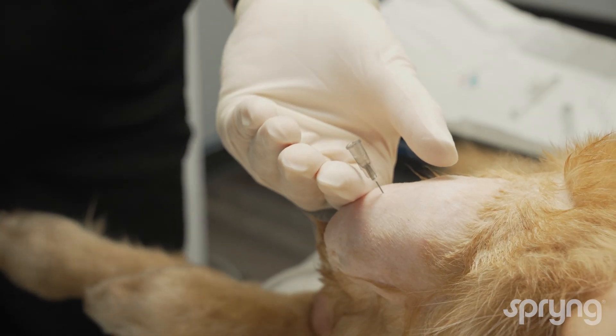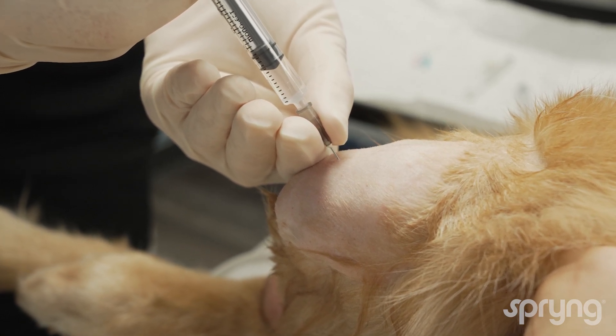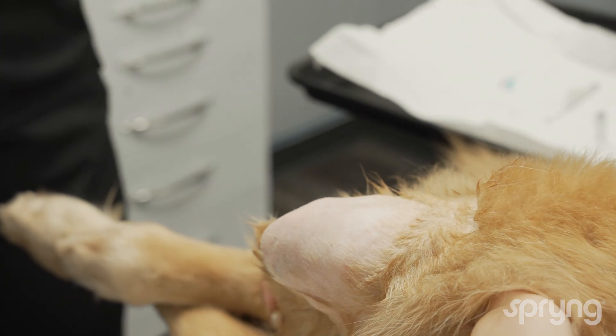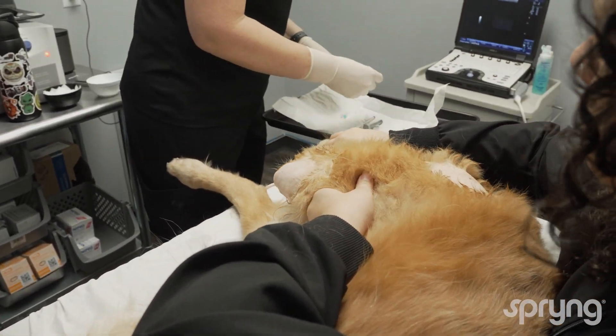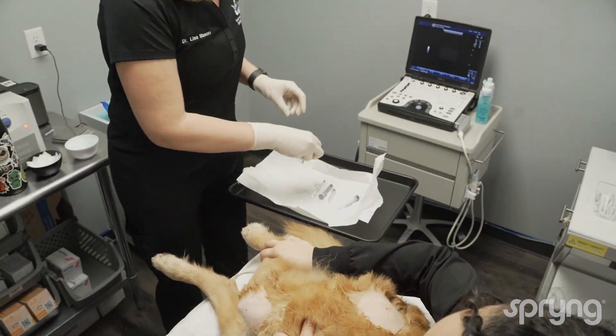Ultrasound guidance may be necessary for some patients. Remove the needle and perform range of motion. Apply an ice pack for post-injection comfort.